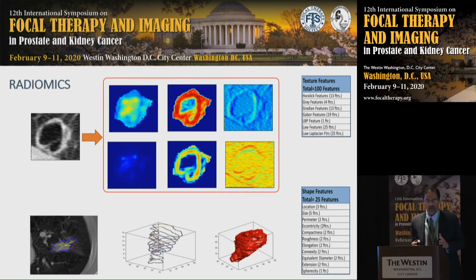A large part of what I'm going to talk about today is really focused around radiomics, or this concept of capturing representations from the image that are subvisual, things that a radiologist may not be able to visually ascertain from a radiographic scan, but essentially could tell us in a more quantitative, more reproducible way, features that relate to the morphology of the disease. And so the radiomic operators have really been around for a while.